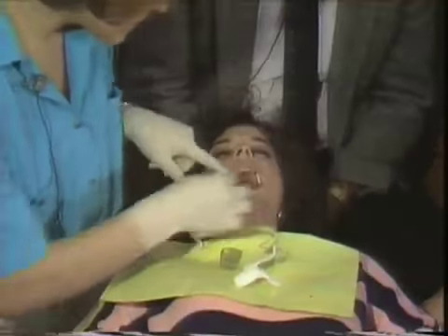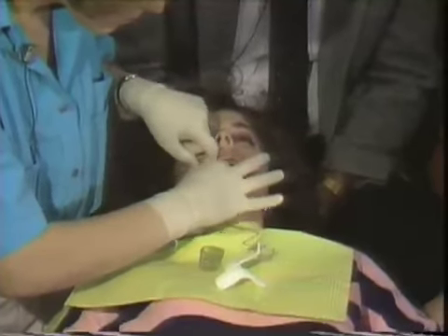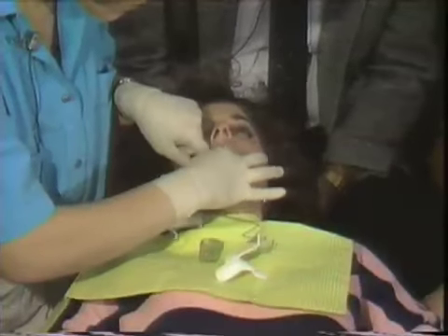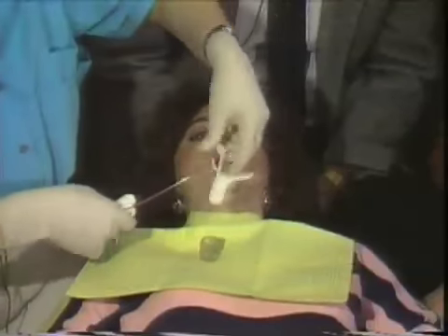Isolation and maintaining a dry field is critical from the time that you start etching all the way through the bonding procedure to ensure that you have a good, clean area to bond to. Therefore, proper isolation using cheek retractors and dry angles, I feel, is critical regardless of the bonding procedure.